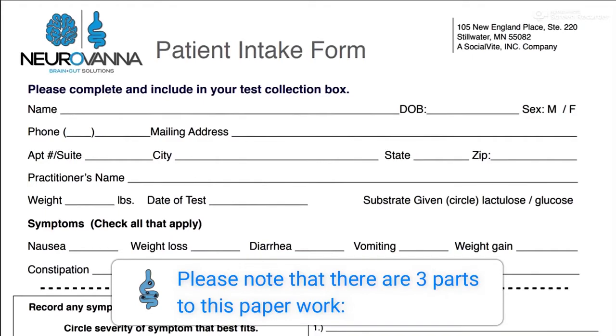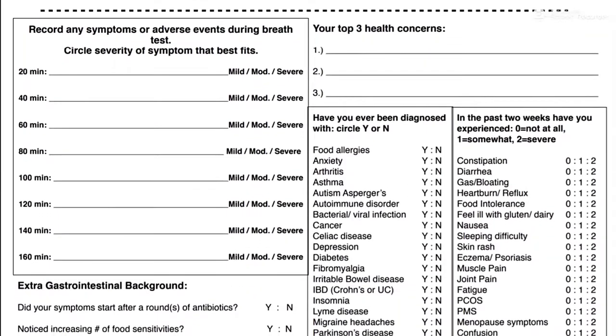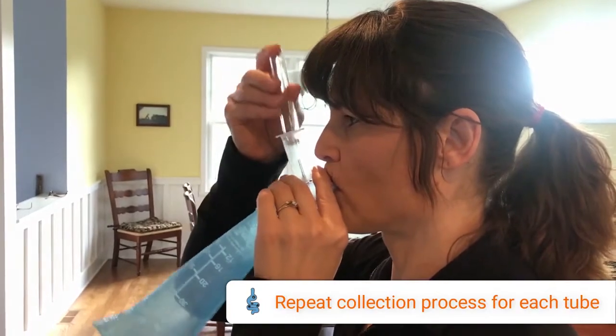Please note that there are three parts to this paperwork: Personal Info, Brief Medical History, and Symptom Summary. Repeat the collection process as directed in your instructions.